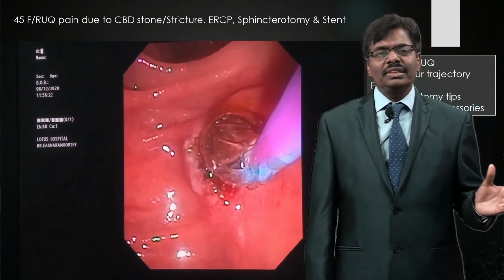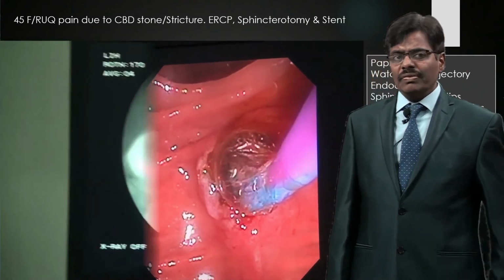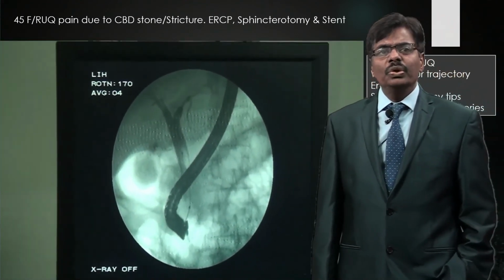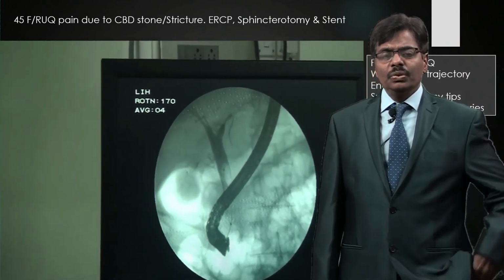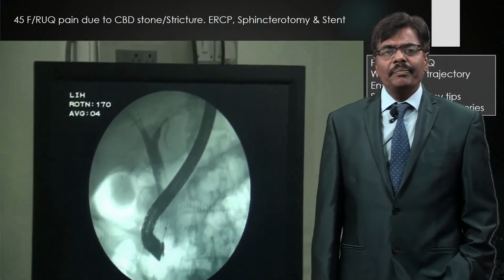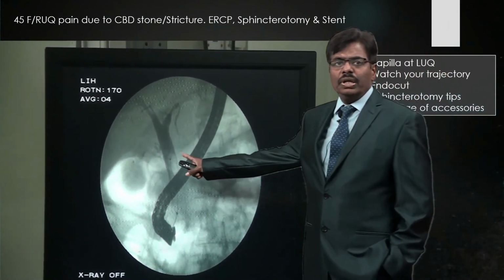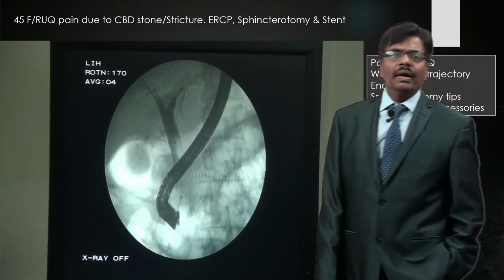Wait for about 30 to 60 seconds, then deflate, then balloon sweep, like what we do, it becomes like a habit for you. So as we do a CRE balloon, again you can see it has been monitored, and you can see the filling defect. Actually what you see is because of the CRE balloon here.